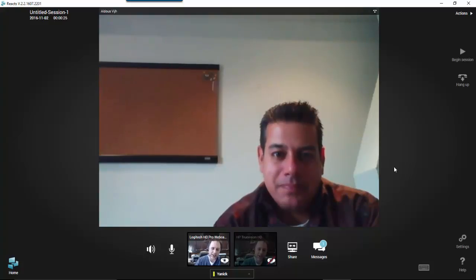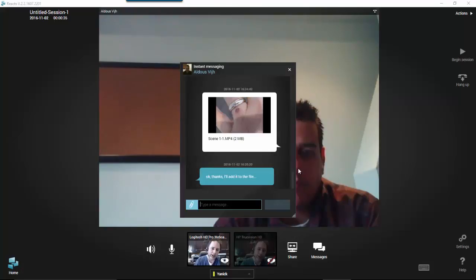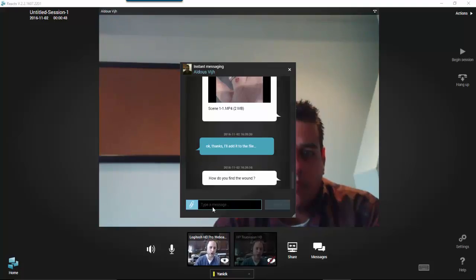And you can see here in the meantime, Aldous had replied to the message I sent. So if I go to messages here, I can see I have one new message where Aldous sent it to me, and he said, okay, thanks, I'll add it to the file. So now if I tell Aldous, how do you find the wound? Instantly he gets that message on his side, and then Al, you can reply something.